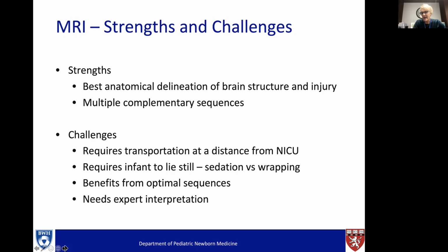It often requires transportation at a distance from the NICU. It requires the infant to lie still, which for many means sedation, or for us, we have perfected being able to wrap most of our infants to keep them nice and still during the scan.